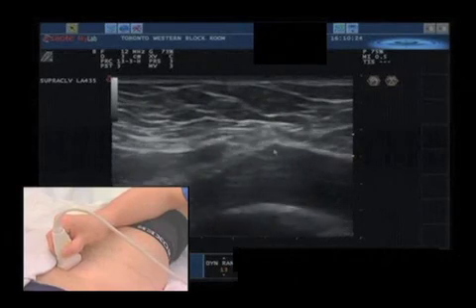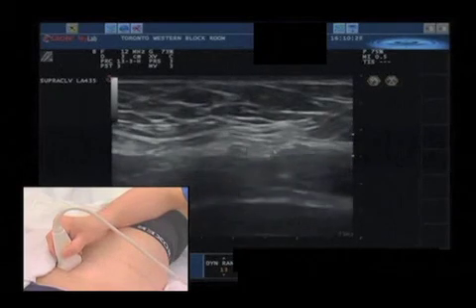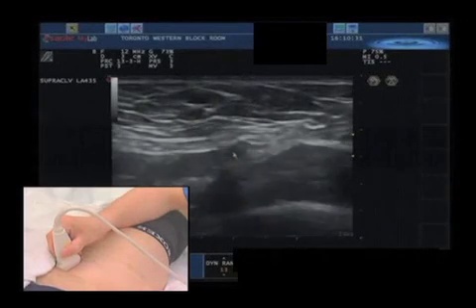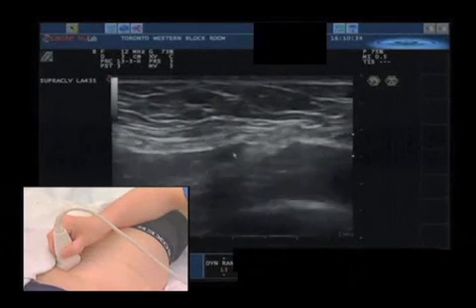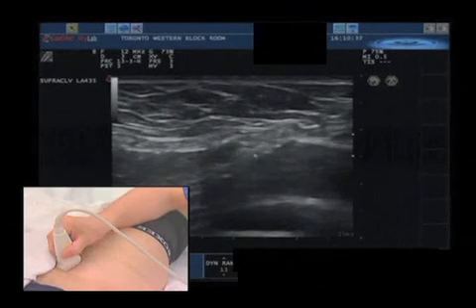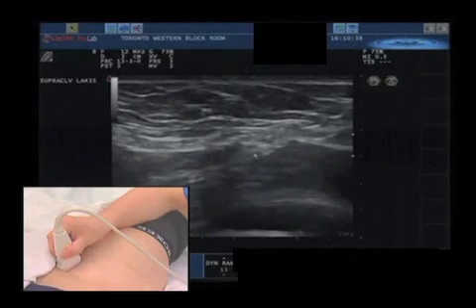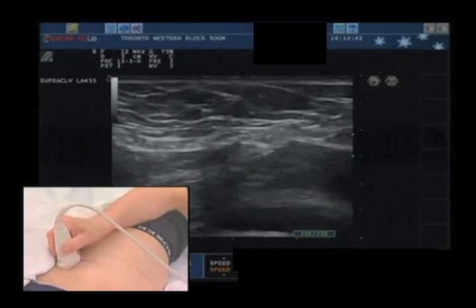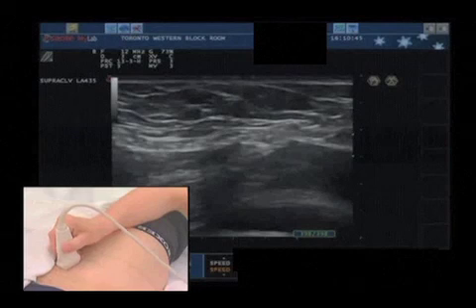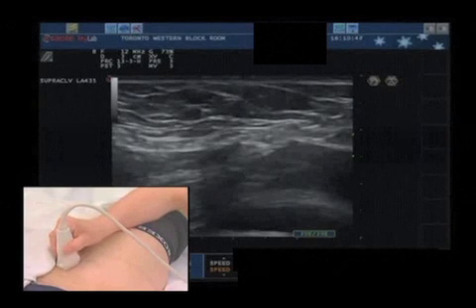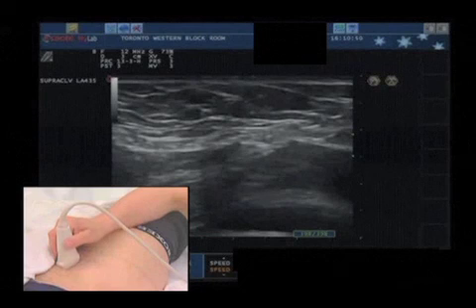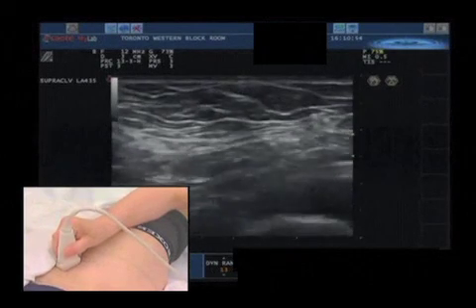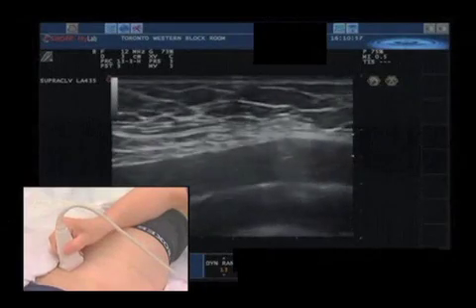With the frequency we use — I use 12 MHz — you cannot see the genital branch of the genitofemoral nerve, but this is not our target. If you use very high frequency above 15 MHz, you would be able to image this nerve, though that is not the regular procedure. We have to admit that only in normal-weight or slim patients will you have a chance to image such tiny nerves as the genital branch of the genitofemoral nerve.